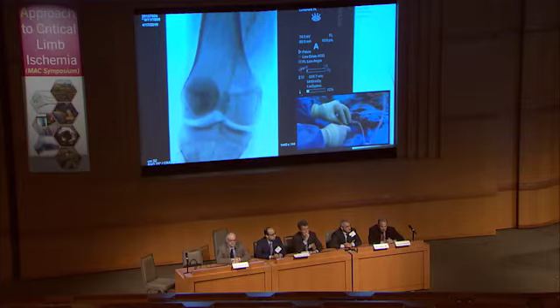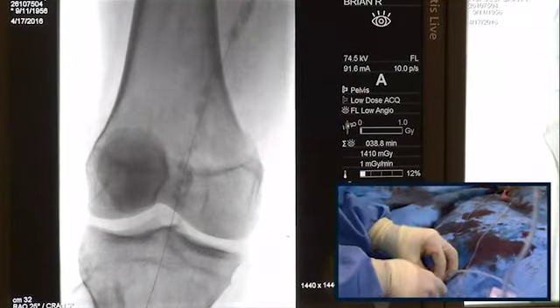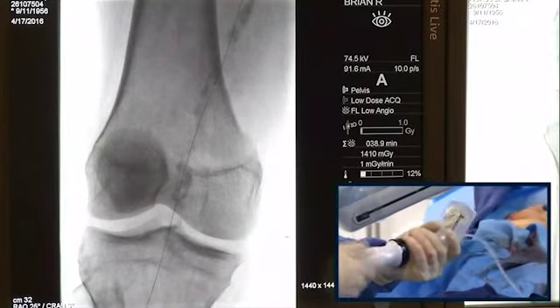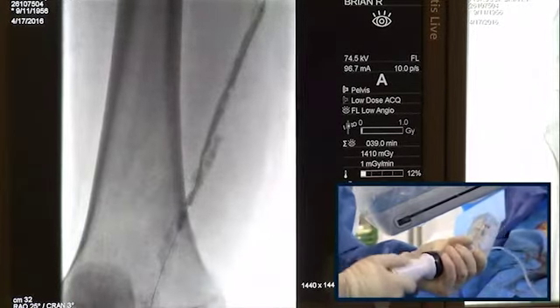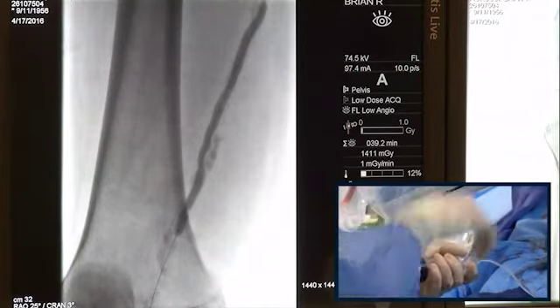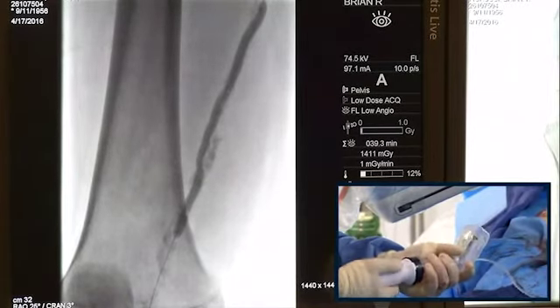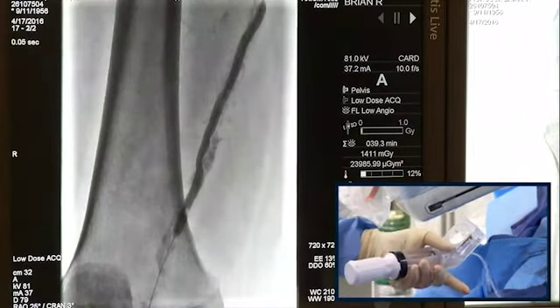Yes, that one area would not be a bad thing to do. I agree with that, past the knee joint. But if you're going to do that, you probably should use distal protection here too, don't you think, for this kind of calcium and this 4 down? Well, it's a very small reference vessel diameter. I don't believe that he will create too much lumen, and as long as you have no flow around the shaft of the catheter, you cannot embolize at the end, at least not with the TurboHawk. But in general, it's something where you should consider protection.